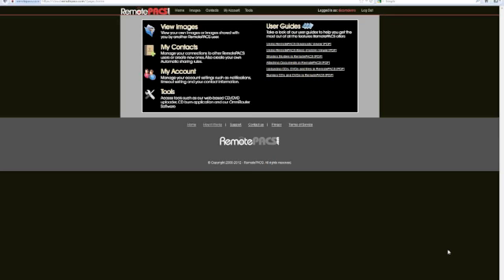And one of the nice things too is we've also added in the routing software where it will pick up where it left off when uploading when the connection is disconnected. So that's specifically to address the issues from mobile imaging users. Do we have any other questions?